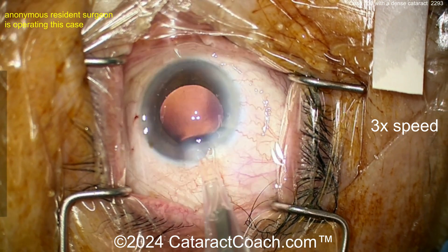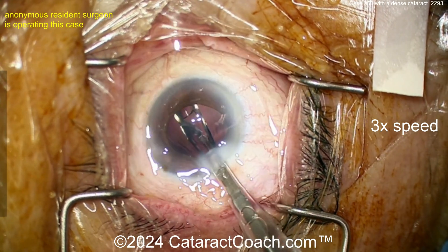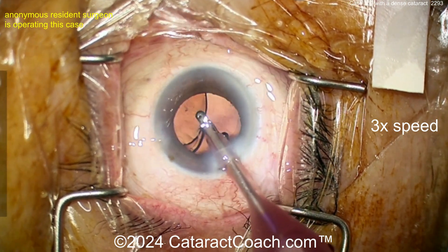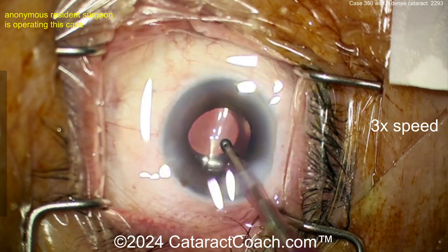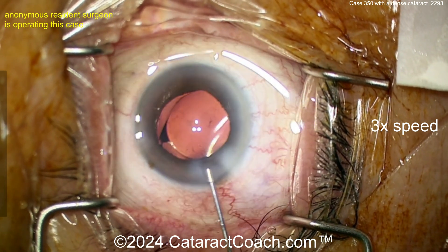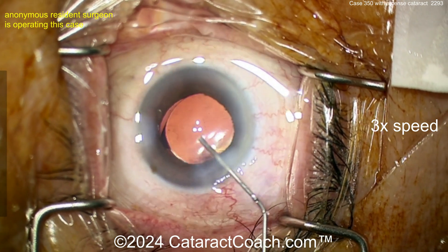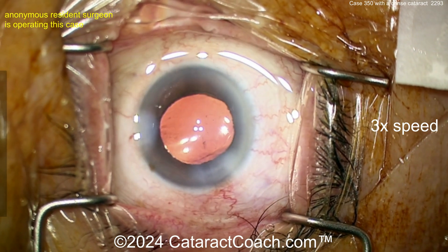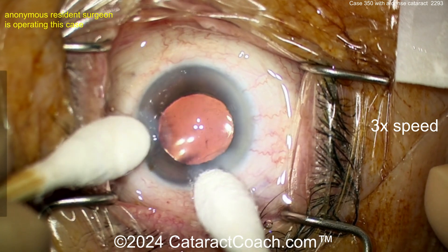Fantastic — a single-piece acrylic lens being delivered. Now get the eye back in primary — hey, hey, hey, what are you doing? Don't do that. Oh no, no, no — that's unnecessary. You can do a better job than that. As you start to get the lens in the eye, keep the eye flat and in primary position. I would prefer using a chopper in the second hand to fixate the eye. That's my one suggestion in this case — I didn't like the IOL delivery at all. I can tell you that because I'm not your friend, I'm your coach. A coach has to tell you the truth and can't sugarcoat it. That IOL delivery must be improved.